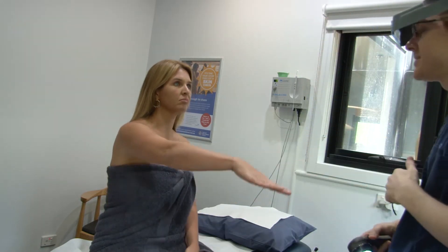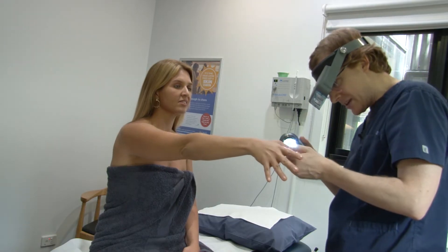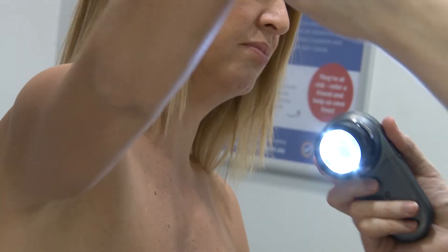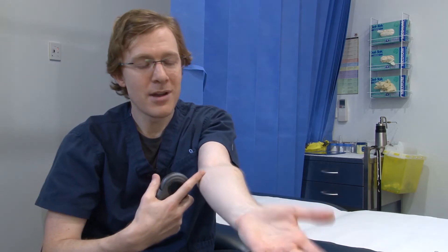Let's have a look at your arm. Would you put your right arm out in front of you? Check the fingernails and make a point of actually touching the fingernails so that the patient remembers that you've checked them. Because if you don't make a big deal of it, the patient's going to wonder if you checked it. An element of what we do is peace of mind in the worried well. So you check the hands — both sides. Check the forearm, then please bend your elbow, raise your arm up, check the next half of the arm, and check the shoulder. Then change hands — left hand, spread your fingers, check the forearm, then the dorsum, then upper arm, arm up, check the armpits.